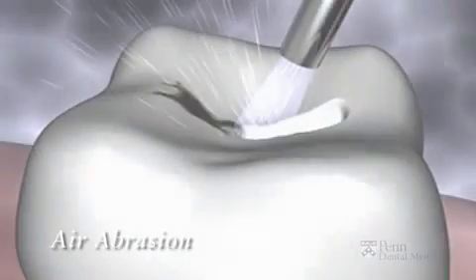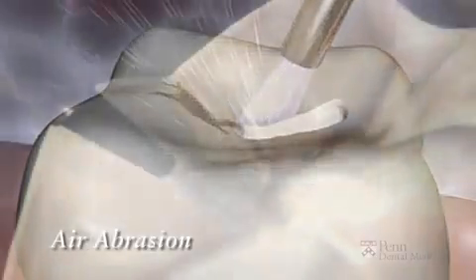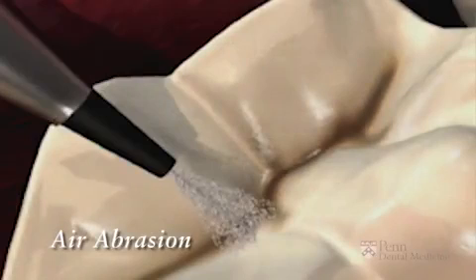One of the most dreaded aspects of the dental office is the dental drill. Patients neither like the vision of it nor the sound. Well, there is some research going on into bypassing this unit. It is something called air abrasion. It is used to treat small cavities. The system uses a blast of air and aluminum oxide pellets to remove decay. It often works without the need for anesthesia. In other words, there are also no needles.